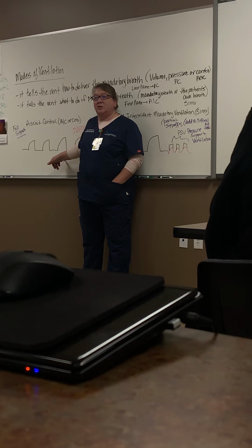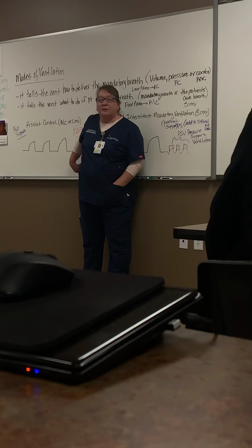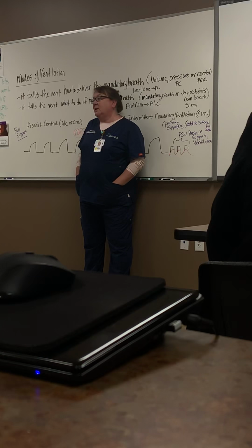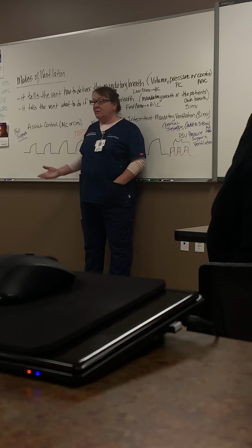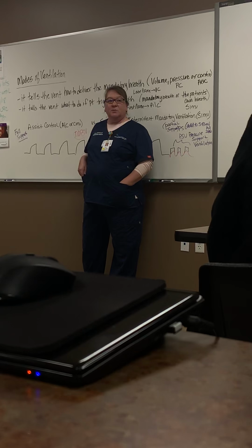I don't really pay attention to how many they trigger. I just want to know if they're doing spontaneous effort. Do they have the ability to trigger a breath? If they don't, obviously you can't wean them. But you might not even know that, and so for sure, if your patient's with it and everything, which they should be if you're trying to wean them, then you're just gonna flip them over to that spontaneous breathing trial.